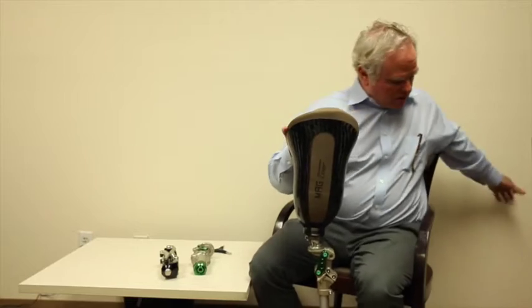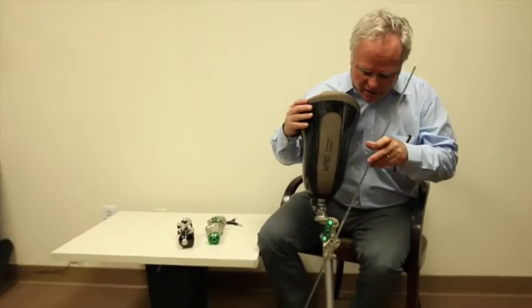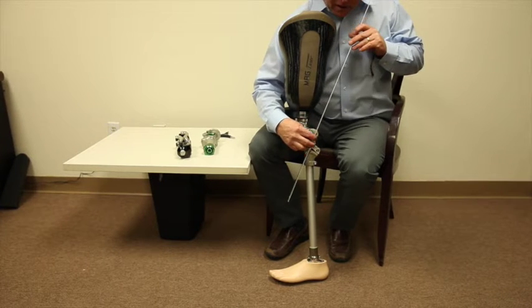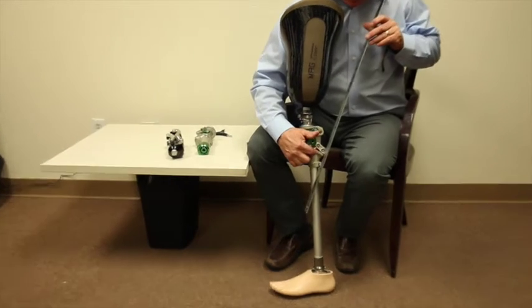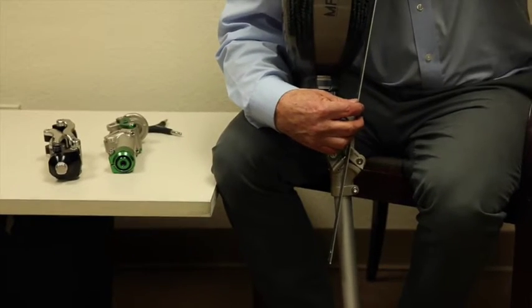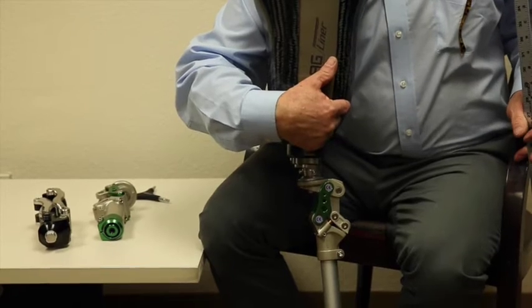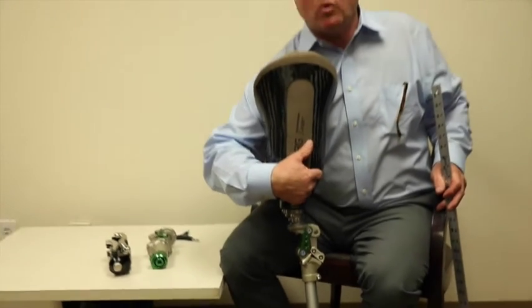In general, if you imagine a line going from this pivot point through that pivot point going up, and you measure another line that goes from this pivot point and that one coming up, they intersect back here. So your knee center in essence is way back here.